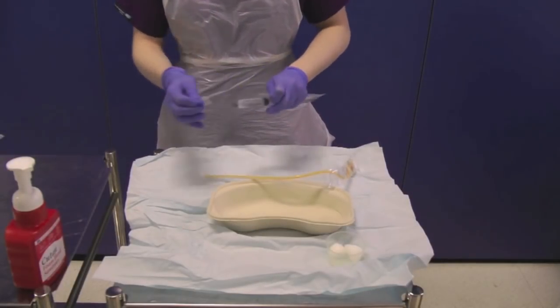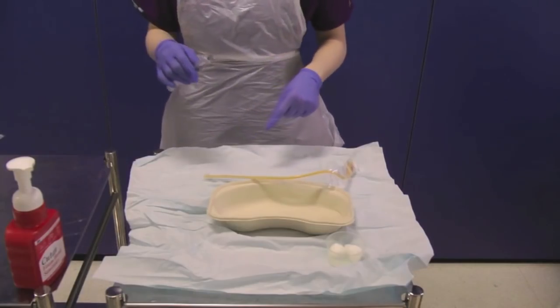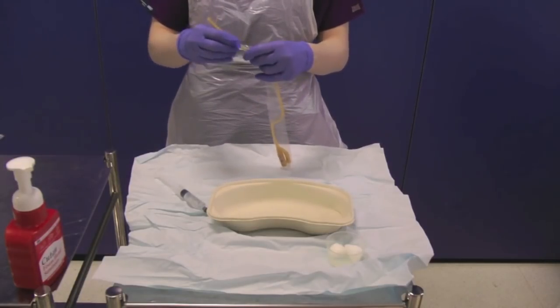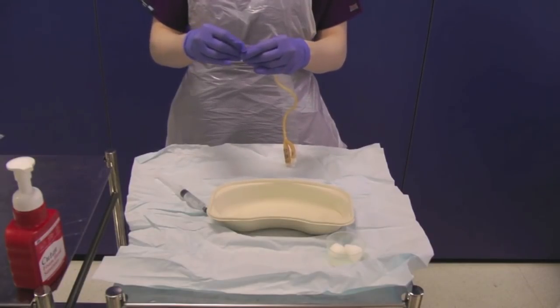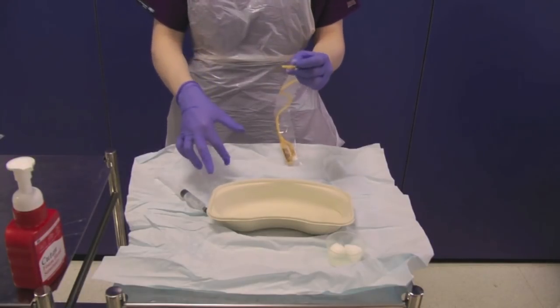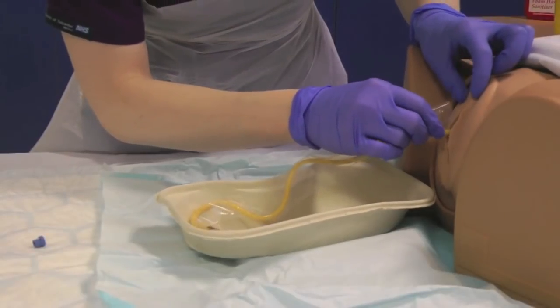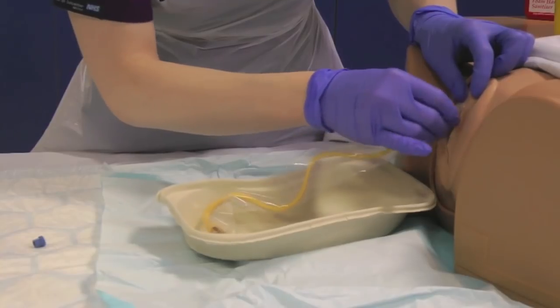Open the 10 ml syringe from its sterile packaging and leave this on your sterile field. Open the urinary catheter from its sterile packaging using the perforations to help you, exposing the catheter tip only. Hold this in the sterile J tray and place onto the bed between the patient's legs. Avoid touching the catheter directly, using the packaging as a barrier.